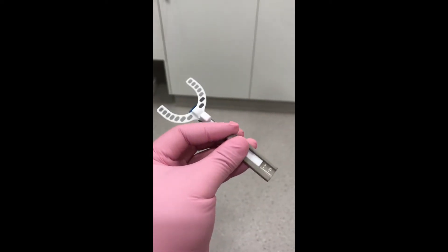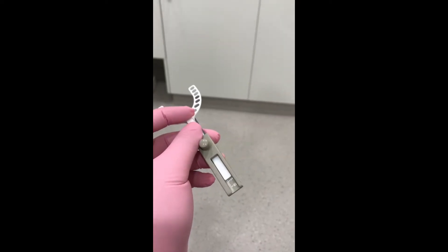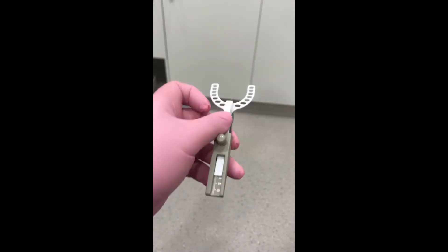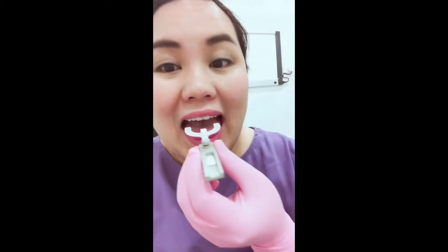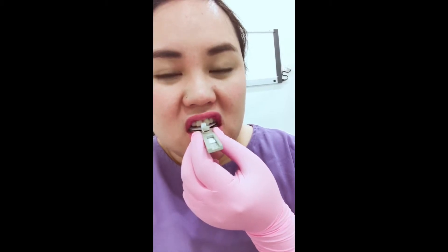You would ordinarily want to start the patient at about 60 to 70% of maximal protrusion, so this result is the number at which you would want to preset the George gauge. Once you've decided on that position, try it in the mouth again to see if it's comfortable. You can adjust if necessary.